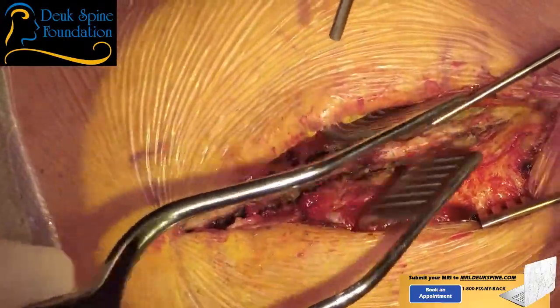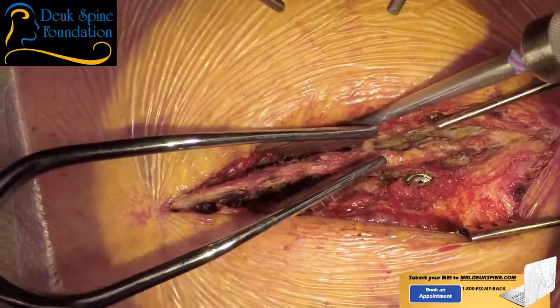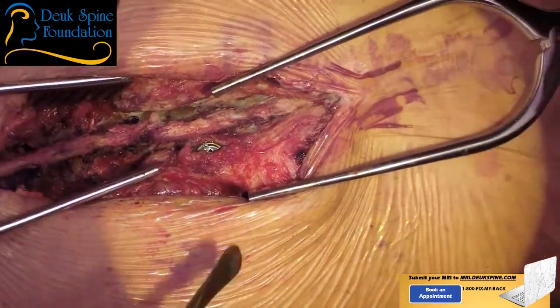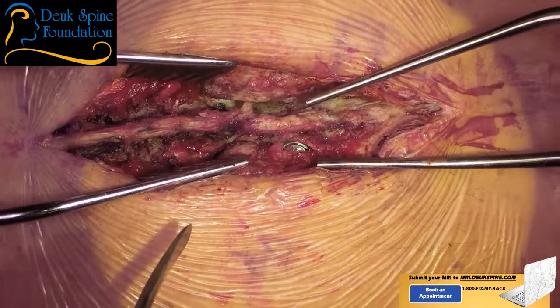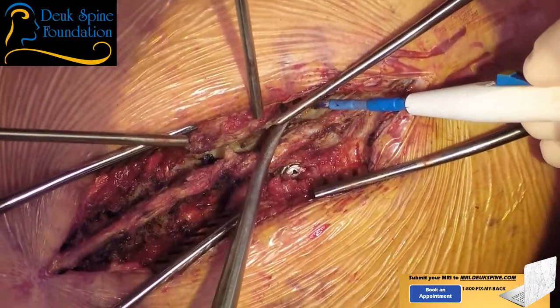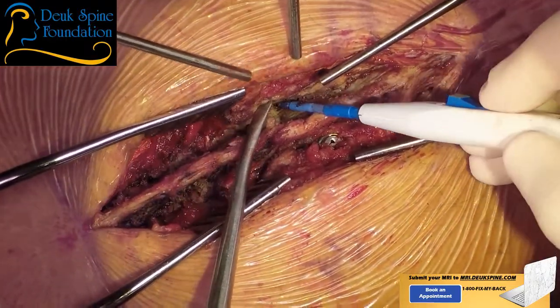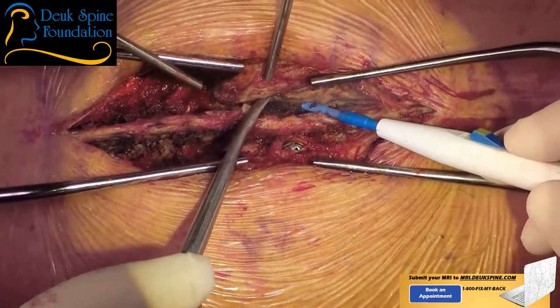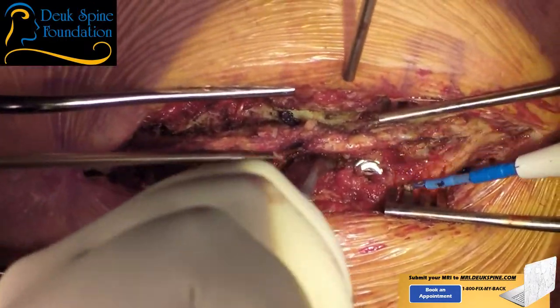Now, part of this patient's problem is that they have osteoporosis. And they have weak bones. So less is always more when it comes to patients with metabolic bone diseases like osteoporosis. Fusing them is hard to do because their bone quality is not good because the bone is sick. The bone is unhealthy. It doesn't act like normal bone. It doesn't get hard and strong, you know, after surgery and fuse nicely. So, you know, whenever you can avoid fusion in a patient, you want to avoid it. In this patient, I think we can get away with it. That's what I told him ahead of time. So I expect that to be the case.